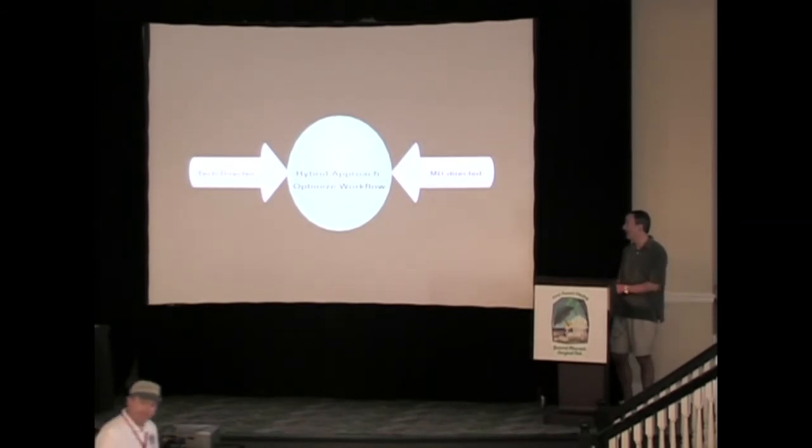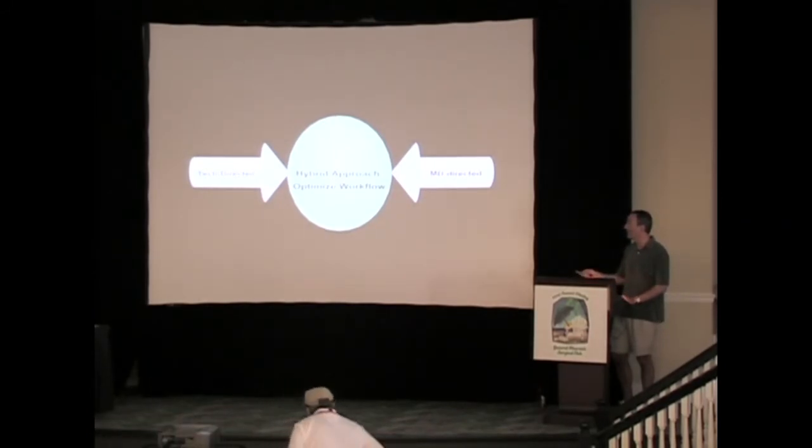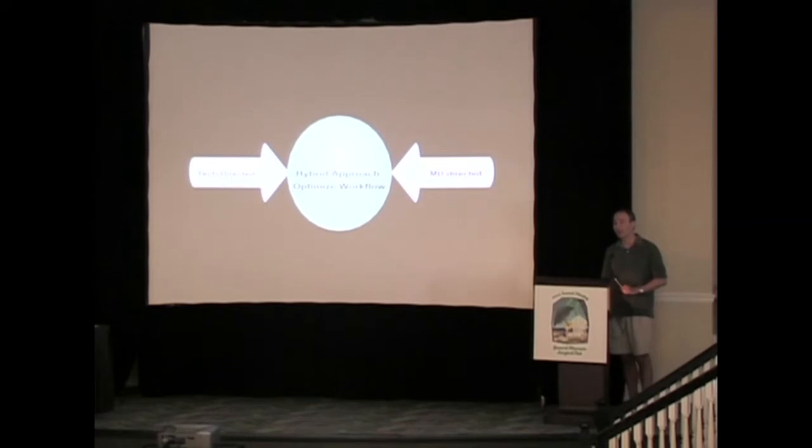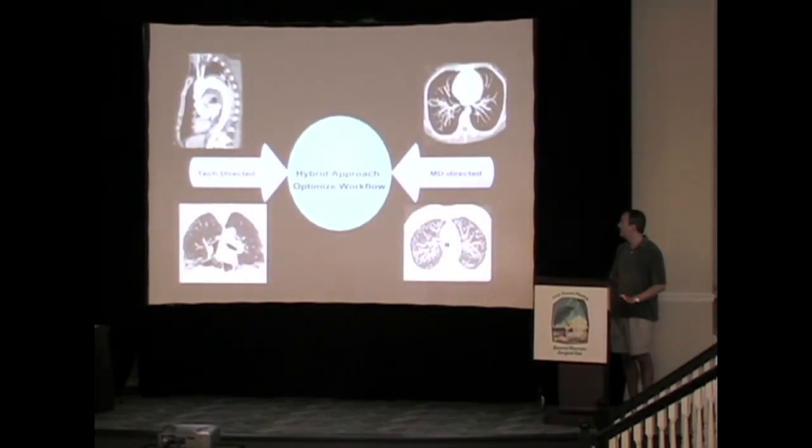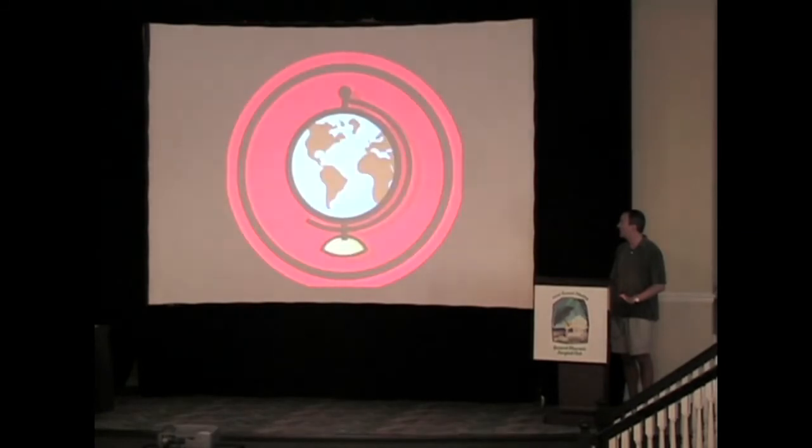So at my department, we have a number of routine protocol type of things for aortas, for airways, where everybody gets 3D multiplanar reformations. We do routine coronal and sagittal for all cases. But then we also have MD directed. If there's a tailored case, something that's very complicated, we like to specify the protocol for things like EKG gating when we get our hands on as well. So again, we have routine tech directed, and then we have MD directed data sets.